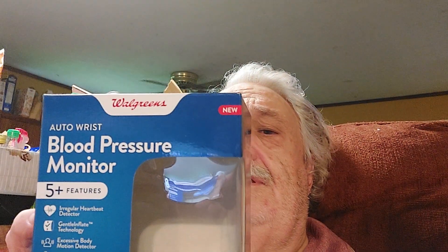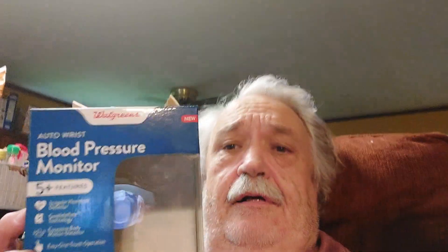Here's the box — auto wrist blood pressure monitor. They said it would only cost 20 bucks, but this was more like 39. They had different models that did a lot more things, but I just wanted to go with the basic, especially after having all the trouble with the Withings one — I didn't need to install it and everything.